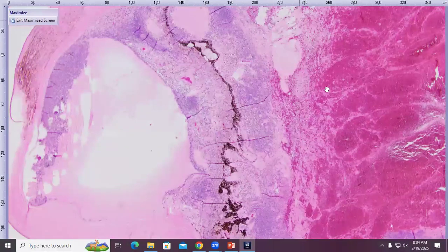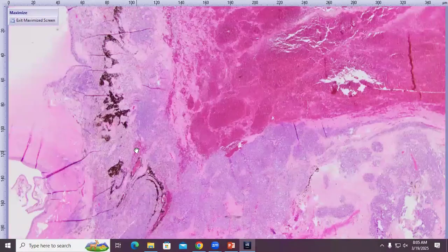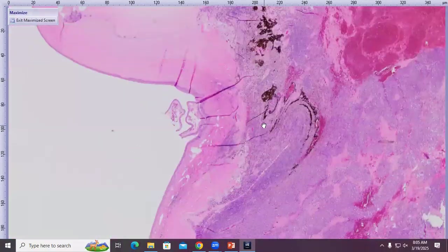Here is the iris, and you can see those areas of basophilia. So that's some sort of cellular infiltrate. The anterior chamber is here. It has a proteinaceous exudate, which is what gave it that translucent gel appearance in the gross photo. And here are more of what are probably neoplastic cells. We see no evidence of the lens or the lens capsule. So presumably it was extruded through, I didn't actually say this, but this is an area of corneal perforation or rupture.